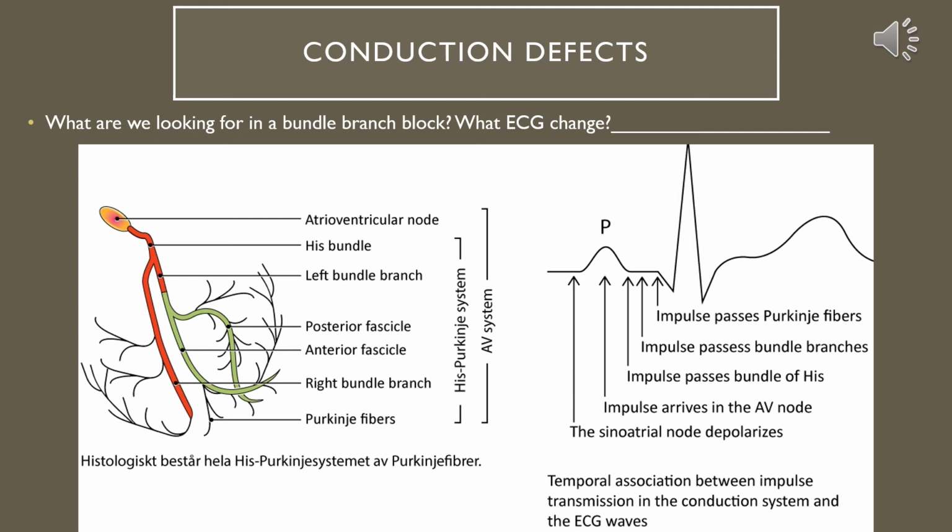In the EKG, whether we see a right bundle branch or a left bundle branch block, what we're going to see is a widening of that QRS. The hemiblocks do not cause that EKG change. Generally, they still have good conduction because there is still part of that left branch that's working, whether it's the posterior or the anterior.